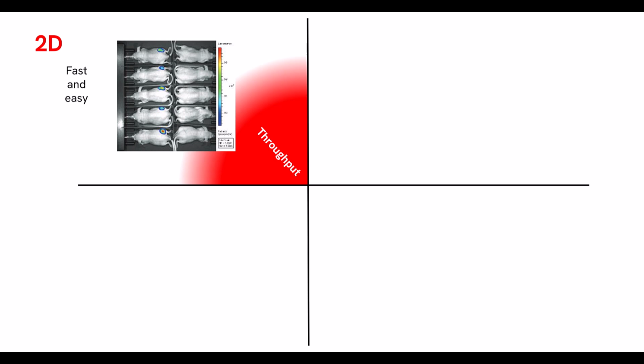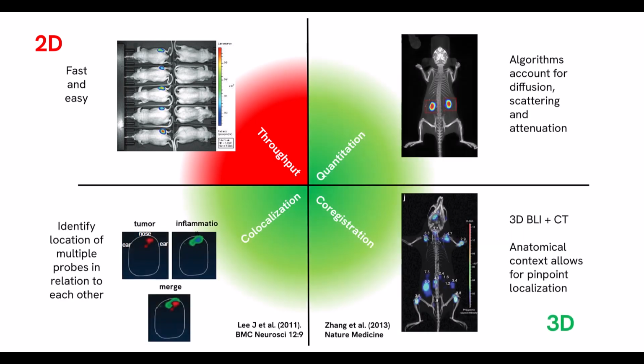Therefore, diffusion patterns are not entirely representative of the location, and certainly give us no information concerning depth of the sources in the animal. 3D tomography helps further that biological characterization by allowing pinpoint localization of your probe within the animal. Tomography also allows for quantification of a fluorescent agent's accumulation within the tumor or intended target in absolute concentration units. In addition to our 3D optical reconstructions, we will also be performing micro-CT imaging to co-register functional and molecular optical readouts with anatomical high-resolution micro-CT data.